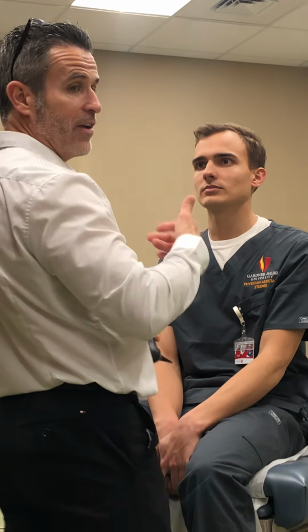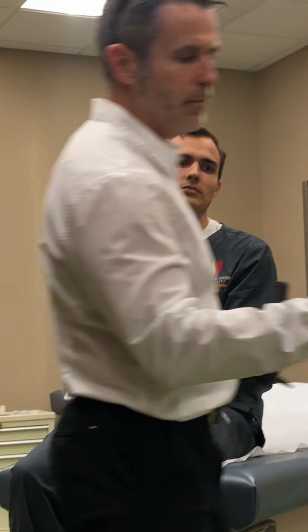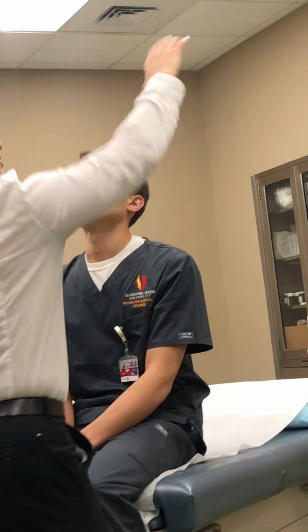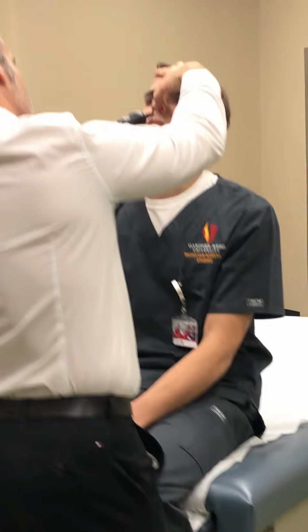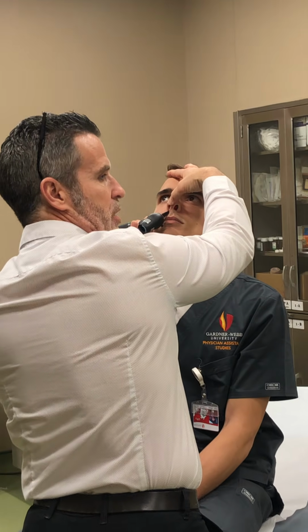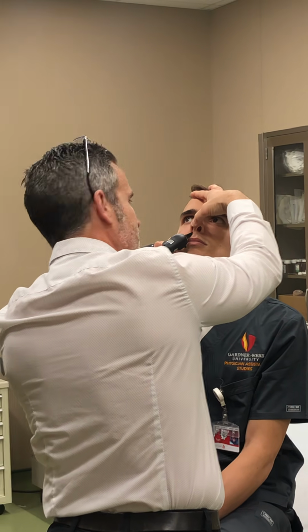So you can have him make a pig nose, or you can make a pig nose yourself. I prefer to make the pig nose, because I can control where I need to move my speculum. So just lean back, this won't hurt. Everybody watch how I do this at the base of his nose. So first, I put it at the base of his nose and look around. As I go in, I'm putting slight downward pressure on his nose so this holds in place so I don't jab him when I go to look at it with my eyes.